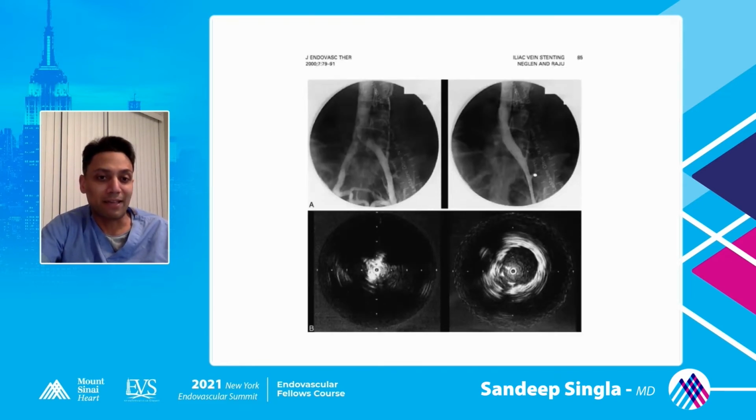This is a classic example of how pre and post stenting intravascular ultrasound will appear. The one on the bottom left shows the image pre-stenting with this tight compression, and the one on the bottom right shows post-stenting, where you see a good lumen and the stent is well expanded.